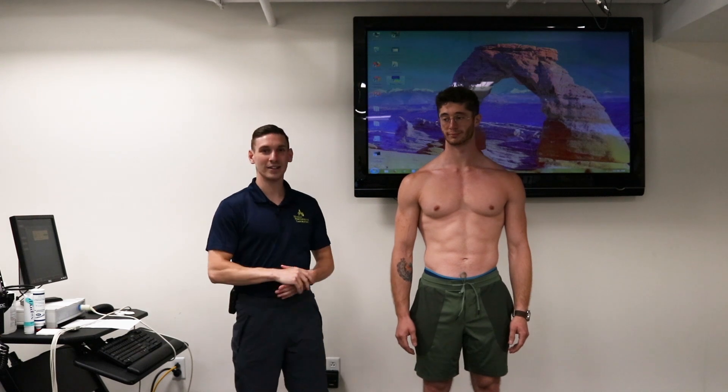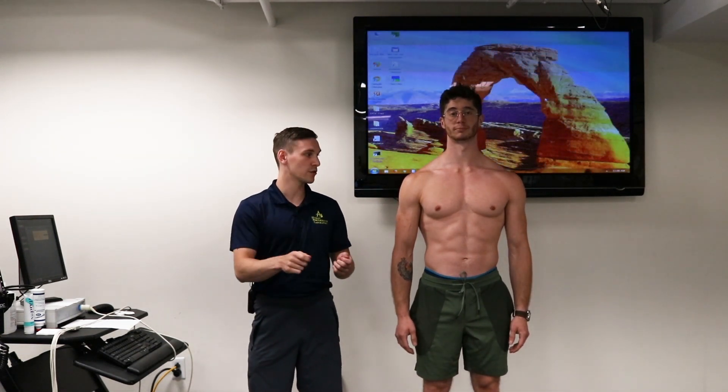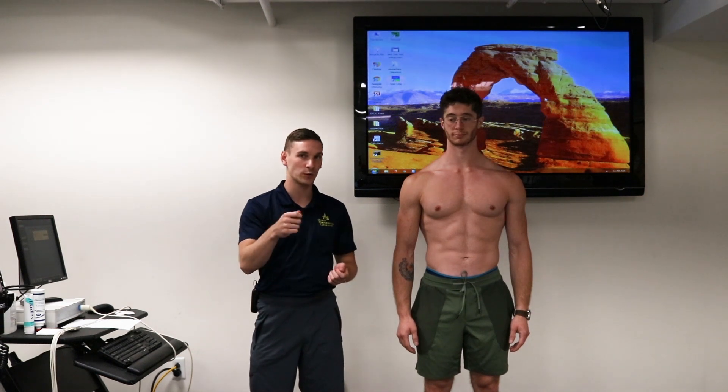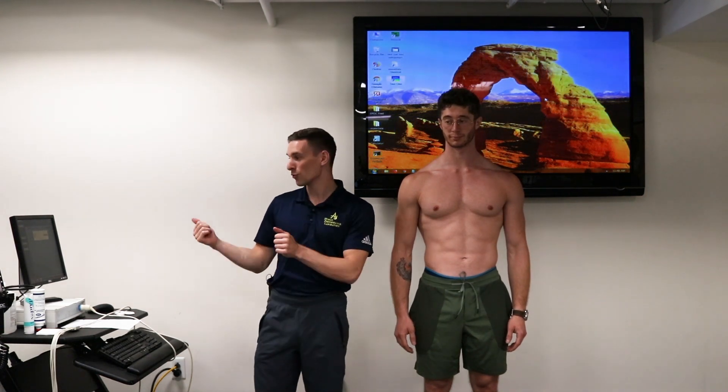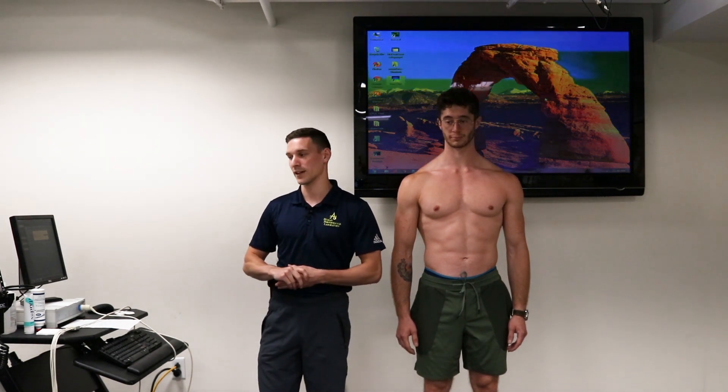Carmine has agreed to be our subject. I'm going to be putting him through the prep, showing you where to place the electrodes and how to apply them, and then I'll take you through the software, the setup, and the calibration before we get started with our test.